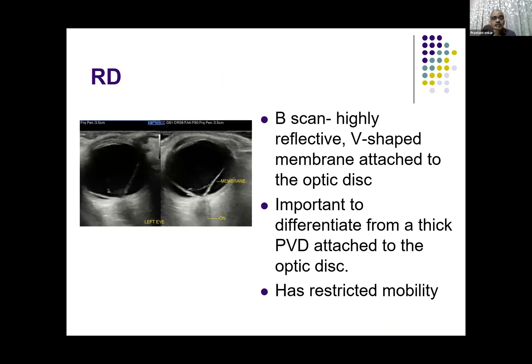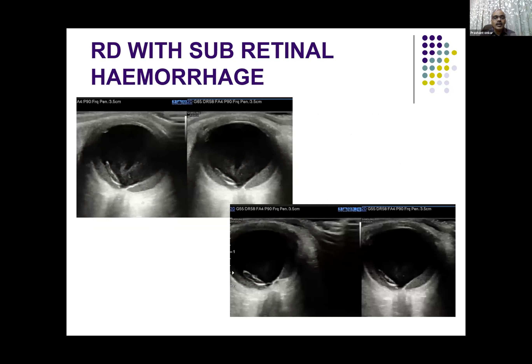The vitreous, in most cases, is not attached — though sometimes it may get attached. The retinal mobility is very restricted, whereas the vitreous moves in an undulating or jiggly fashion. This case shows retinal detachment with subretinal hemorrhage — that can also happen, and we can see it very easily.